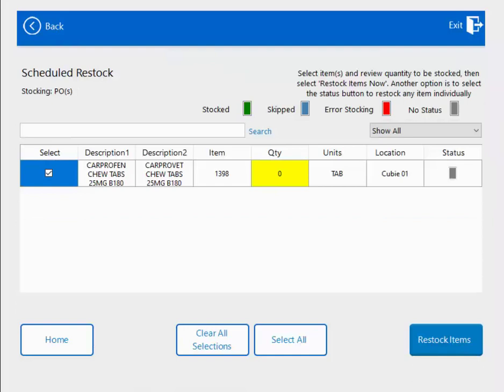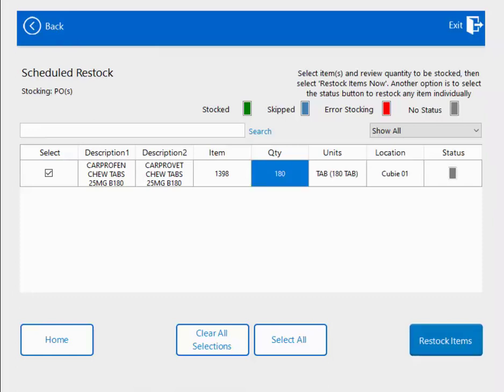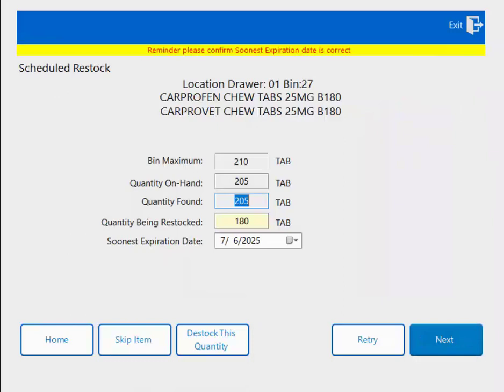Since it's not on a purchase order, I have to tell Qubex how much I'm going to be replenishing. I'm going to replenish one bottle — in this case, 180 tabs. I hit restock items. Qubex is going to open that area. I have my quantity on hand and the quantity found. I could do a quick cycle count if what I find is different. I'm restocking one bottle, 180 tabs. I double-checked that the soonest expiration date is in fact 7-6-2025, and that's the case.